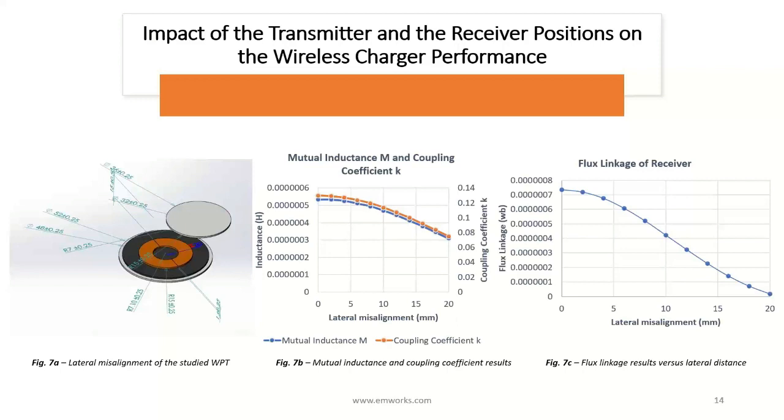So let's see first the impact of the lateral misalignment. Mutual inductance and coupling coefficient results versus lateral distances between the axes of the primary and secondary sides are plotted in figure 7b. Both curves show similar behavior to axial displacement. The mutual inductance, and hence the coupling coefficient, both start to decrease when the axes of the coils are no longer collinear. The flux linkage of the secondary coil behaves the same, as can be seen in figure 7c.